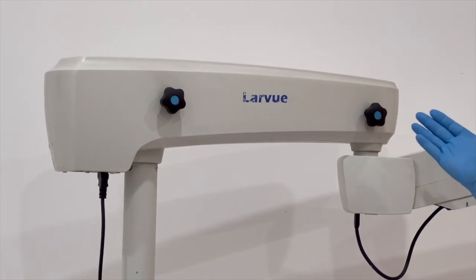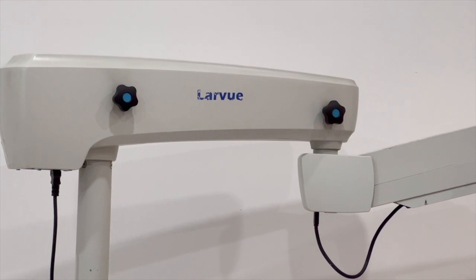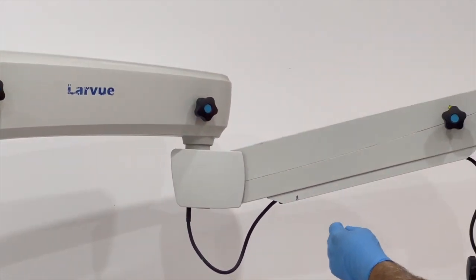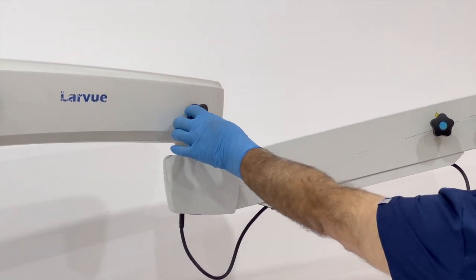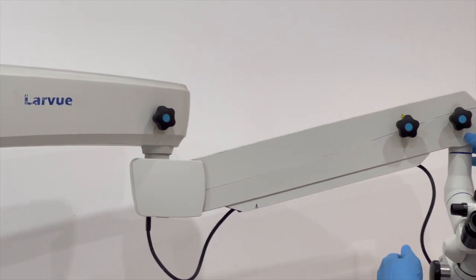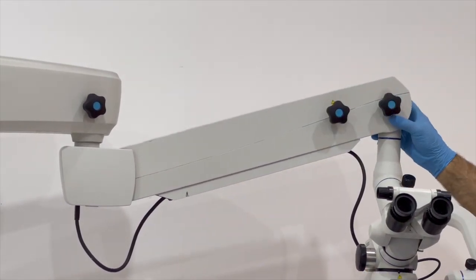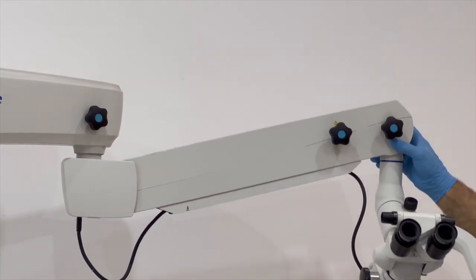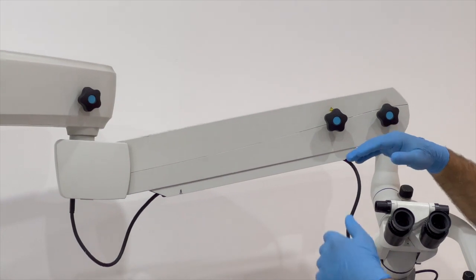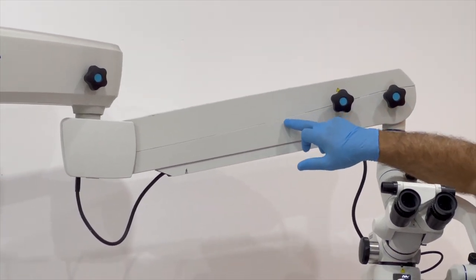Then this screw is responsible for the movement of the secondary arm. So we have horizontal movement of the secondary arm, and this screw is responsible for tightening and loosening this arm. Then we have another movement in this arm, which is up and down movement. There is a screw, which I will talk about, that is responsible for balancing this arm.